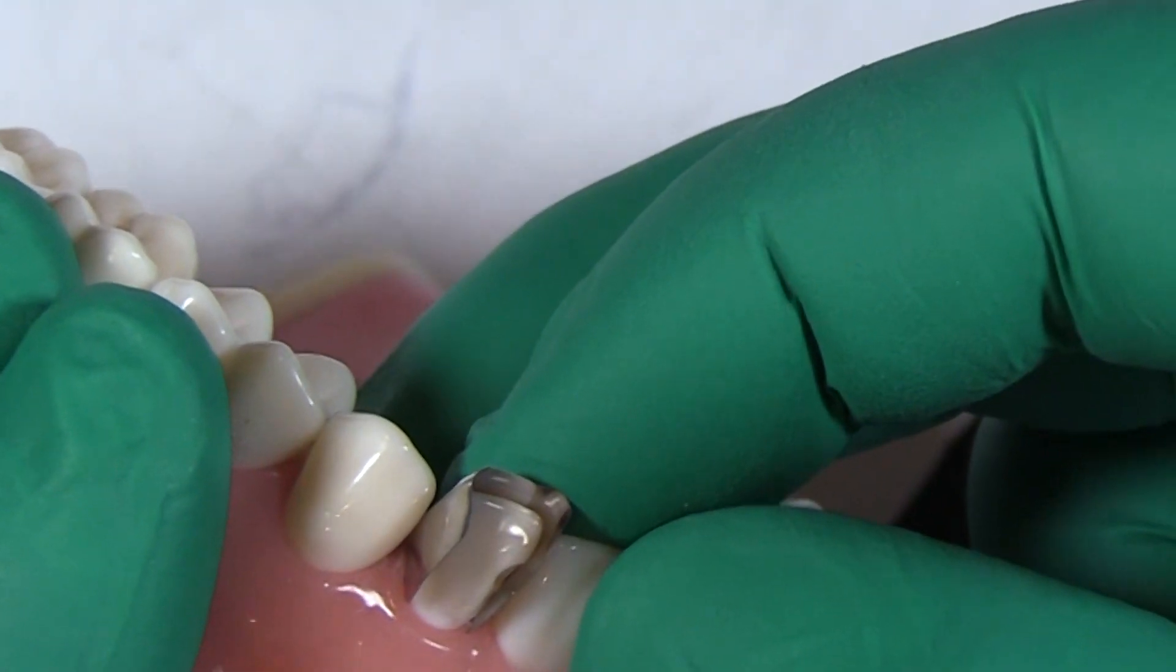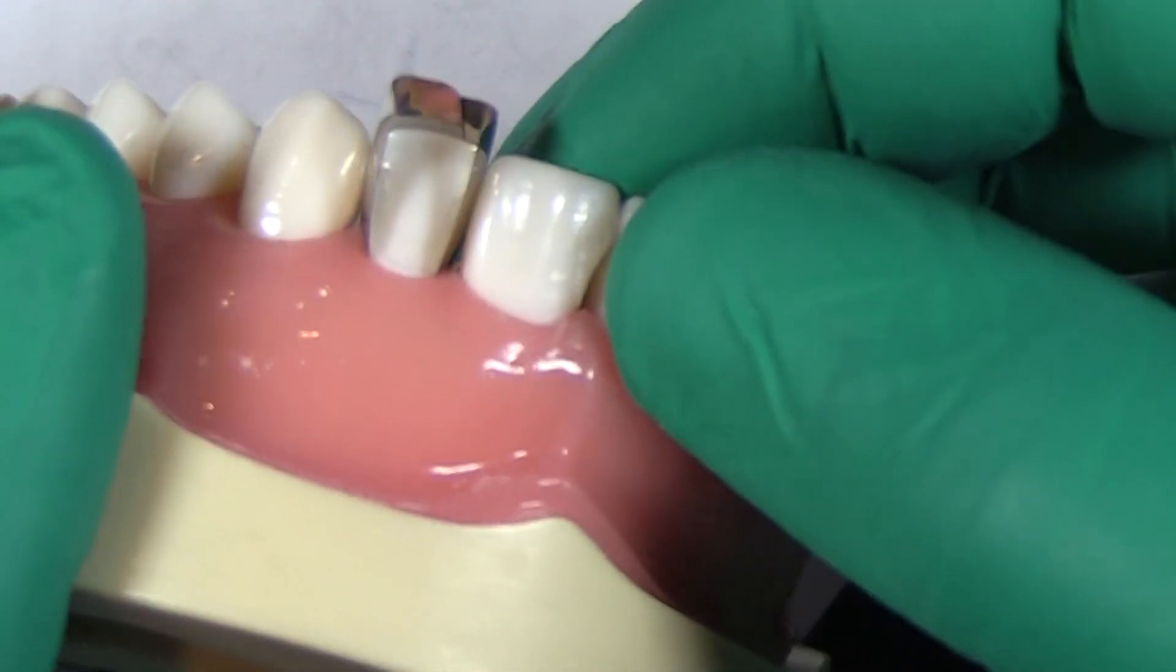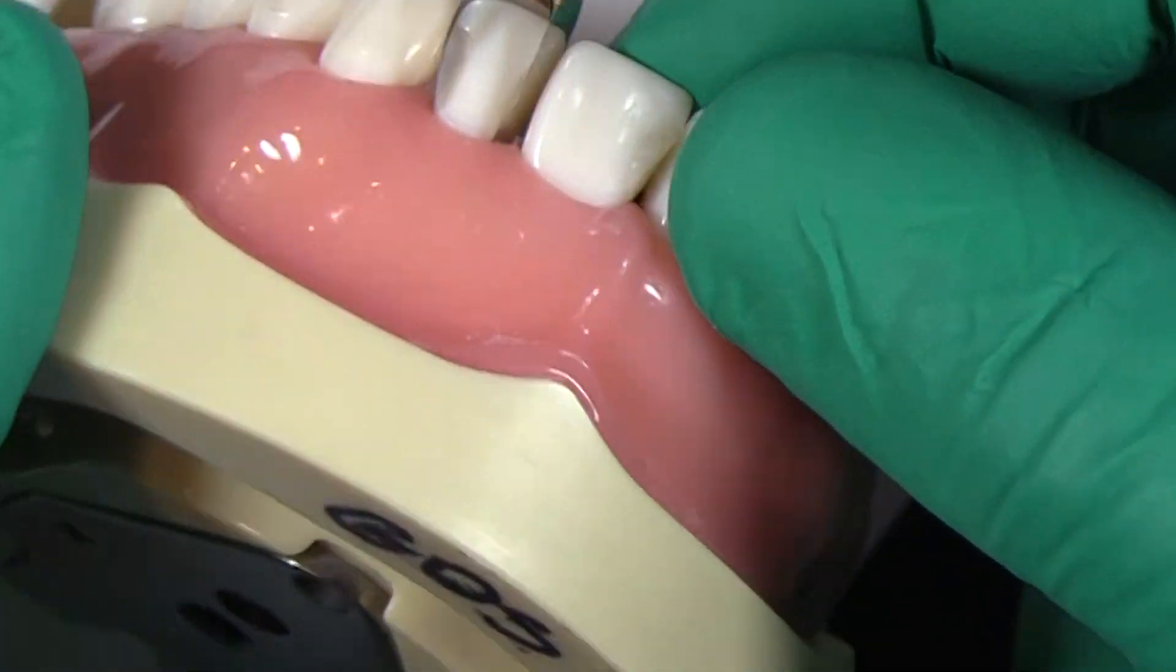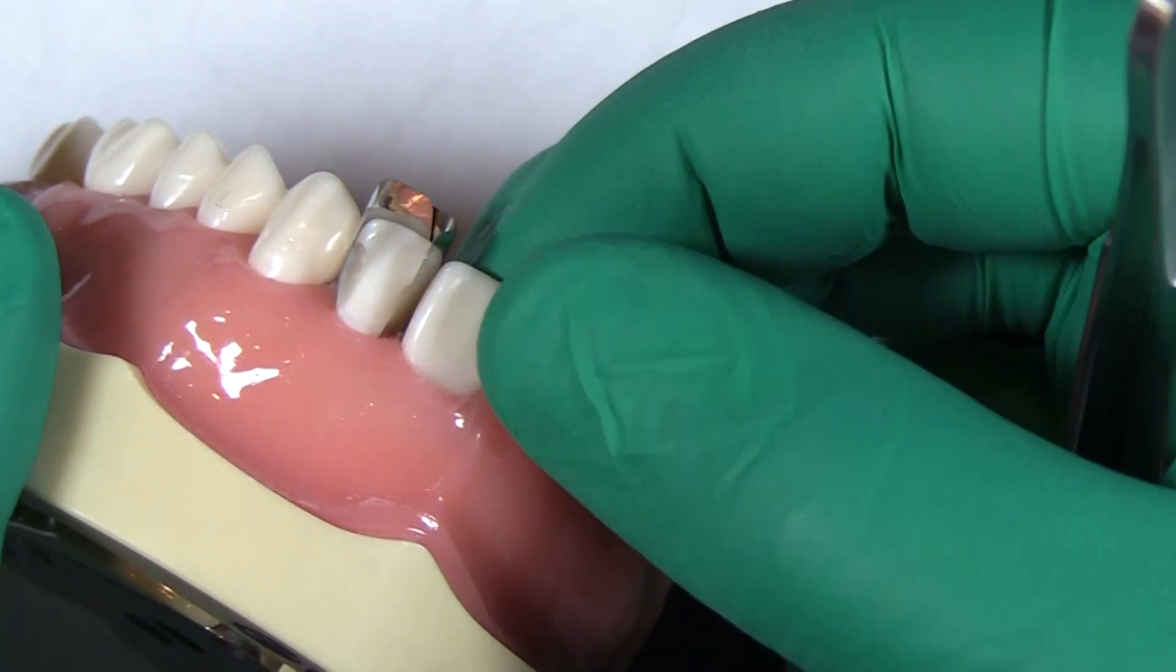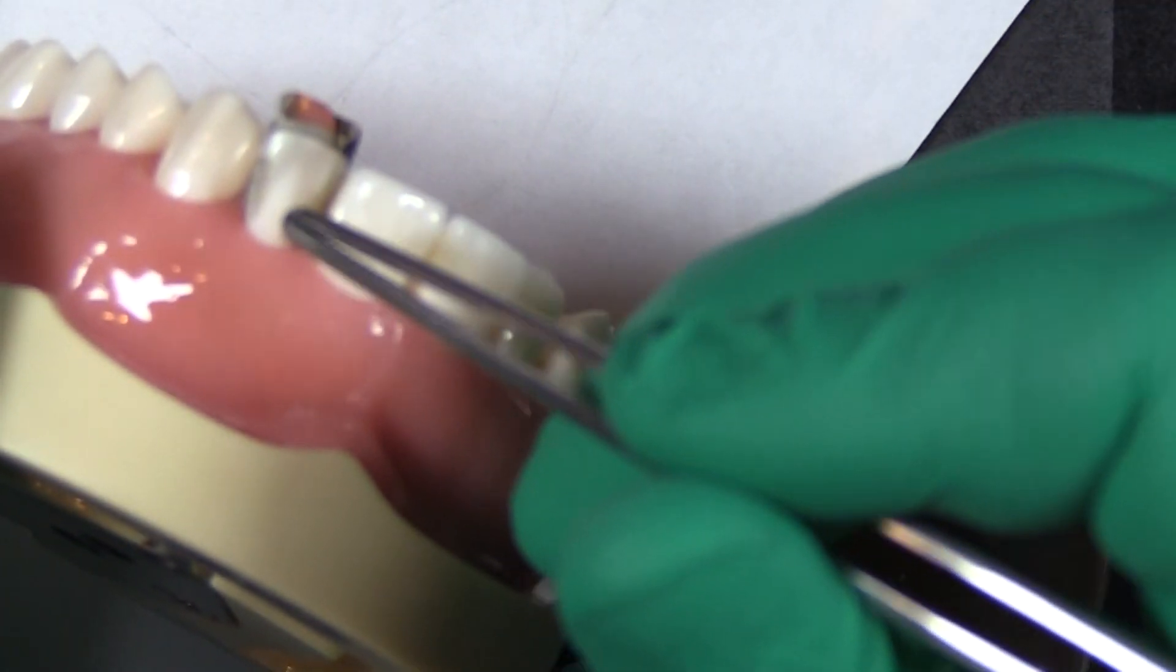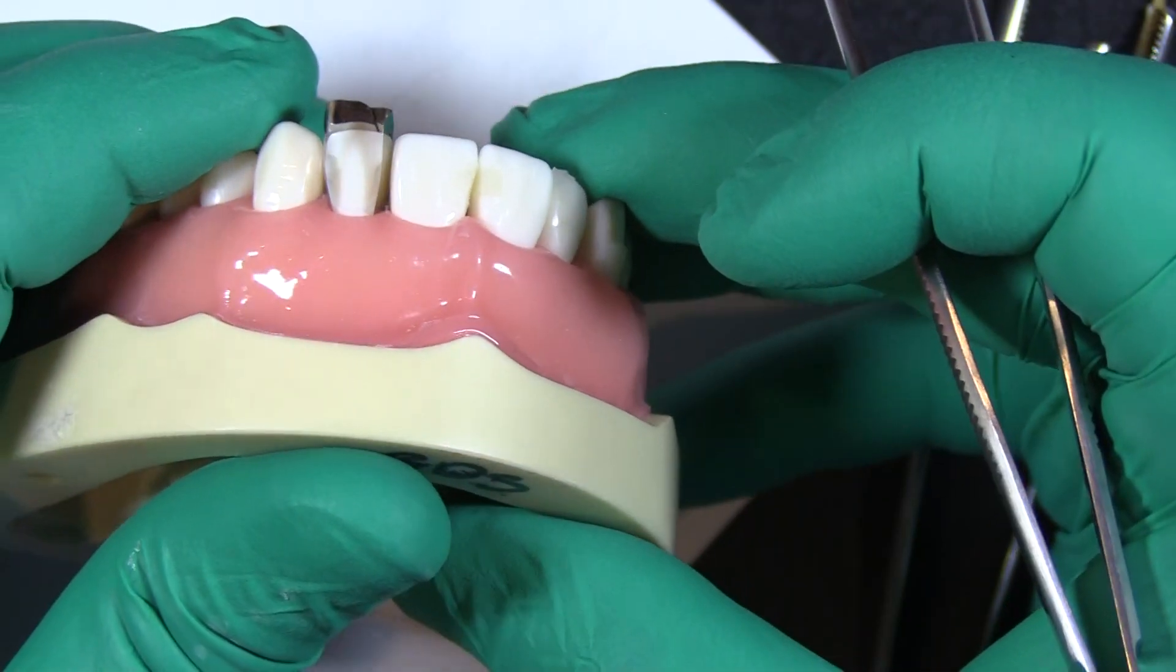Here, and again, that's the wide side is facing down. Look at how nicely without even any wedges in there we're able to have a template. And I do this a lot. I did six through eleven, every tooth looked like this yesterday, and I use this technique for every single one of those.